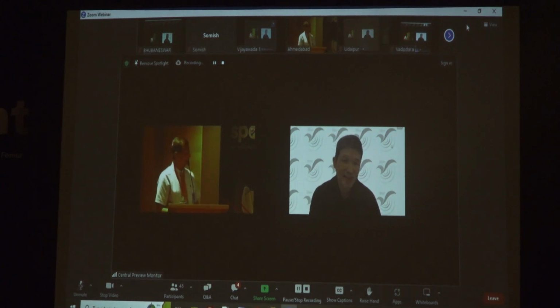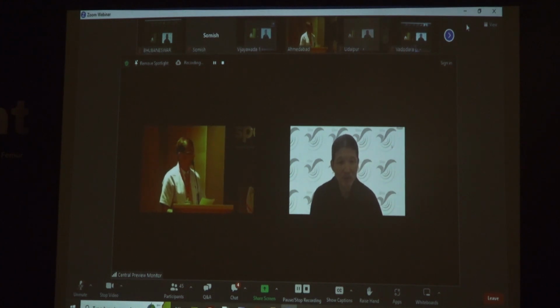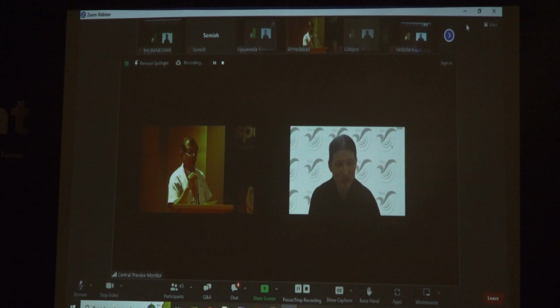Okay, yeah, that happened in my practice also, and most of the time it causes the cut through or the cutout if they have massive shortening. But as long as you have the cement, I have not seen in Japan that they have the cutout or the cut through after the cement augmentation. But massive shortening does occur, and if it sticks out from your lateral thigh, they complain of pain in the abductor muscles. And then at that moment we have to revise it.